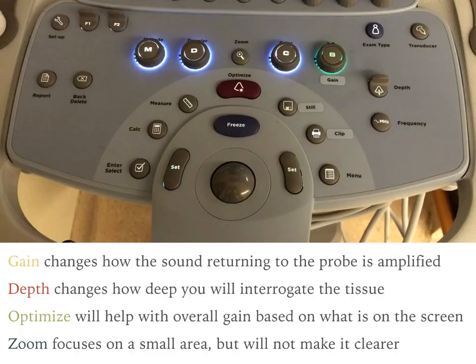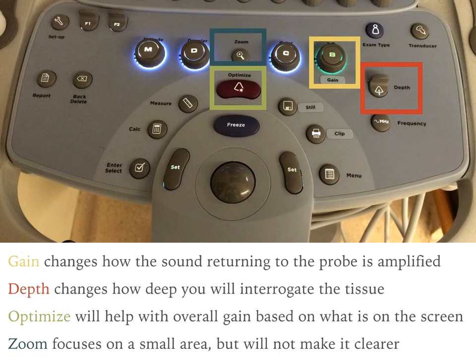All right, we will briefly go over 4 other buttons that can help optimize the image you are generating so you can get the most clinical information from it. The 4 buttons are as follows. Gain, which changes how the sound returning to the probe is amplified. Depth, which changes how deep you will interrogate the tissue. Optimize will help with overall gain based on what is on the screen. And zoom, which focuses on a small area but will not make it any clearer.